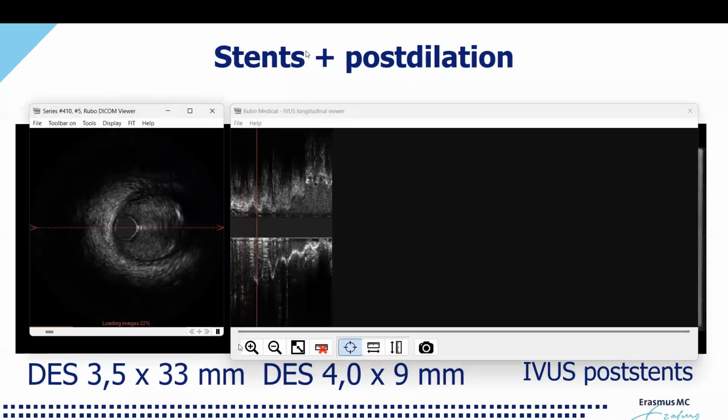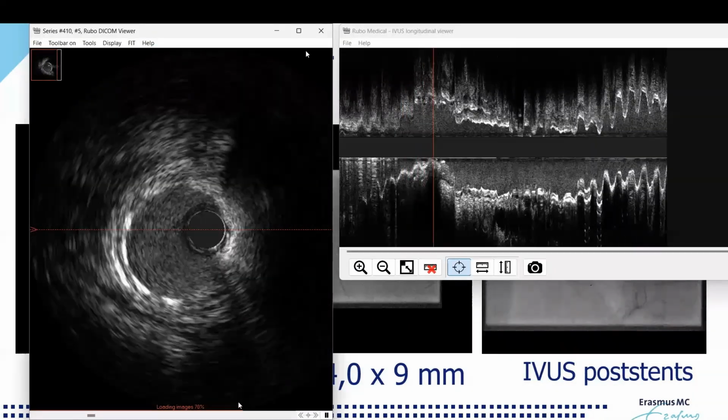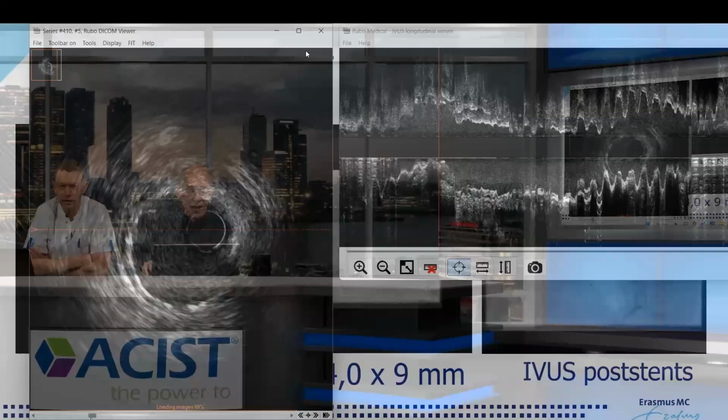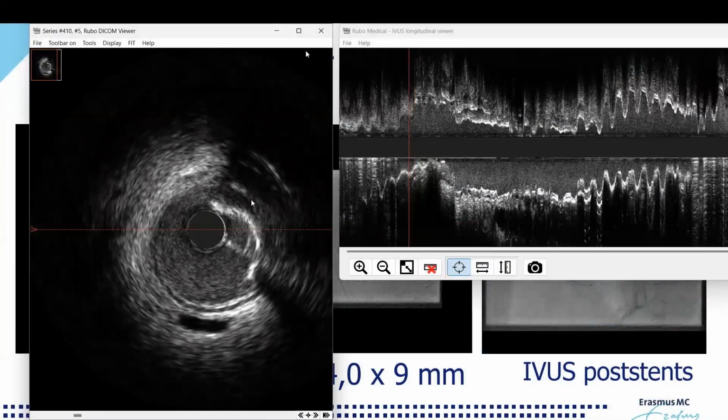Yeah, and please recall distally there was a lot of plaque, which was not covered by metal. So I think the distal stent was for sure needed. With the proximal, I'm not so sure, but that's okay. Yeah. See here we have the distal stent, and we have here indeed some calcified plaque, but that doesn't matter because we have less than 50% plaque burden. If you don't believe me, then I can measure it for you.